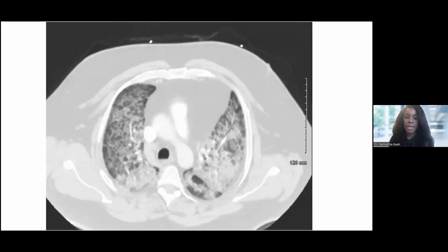And you can see here that this is also largely abnormal, but really it has ground glass bilateral changes, consolidative changes that you can see at, I can't find the pointer here, but that you can see sort of at the posterior aspects of the upper lobes of the lungs. And then you have this pattern on the right lung that almost looks like there's interlobular septal thickening, but it's actually a classic finding that we see in this disease pattern that the patient has, which we'll go through a little bit later.